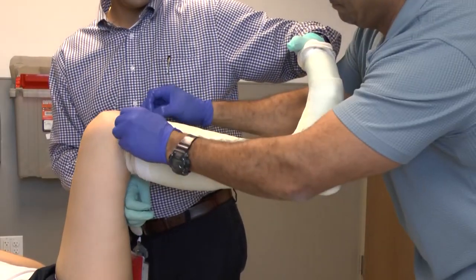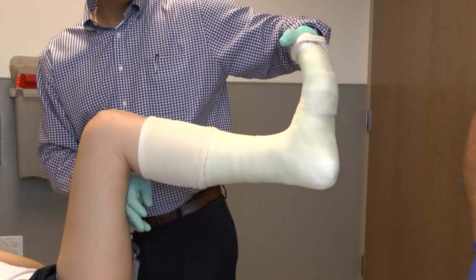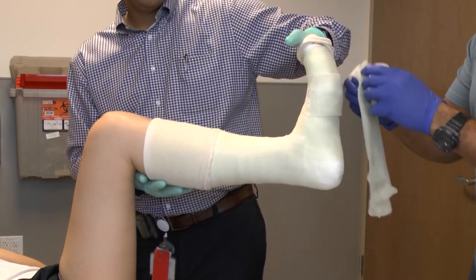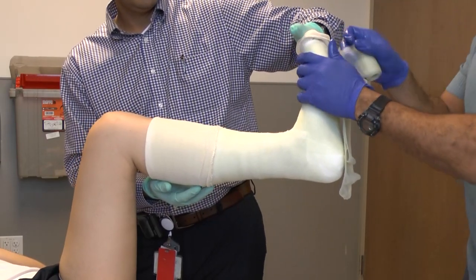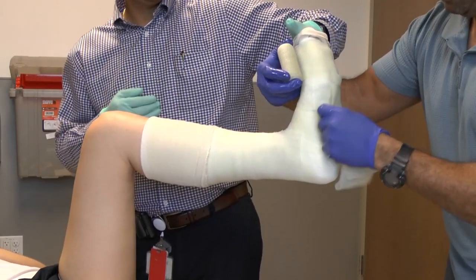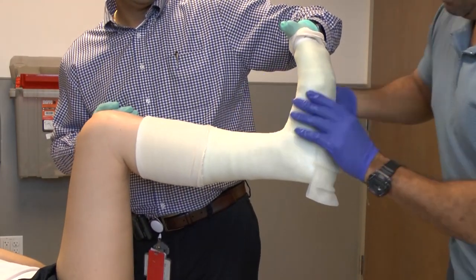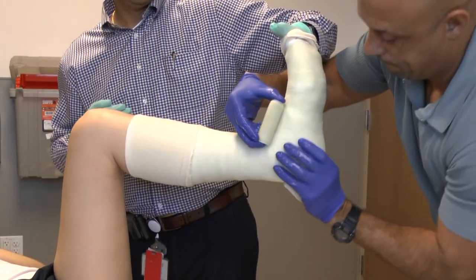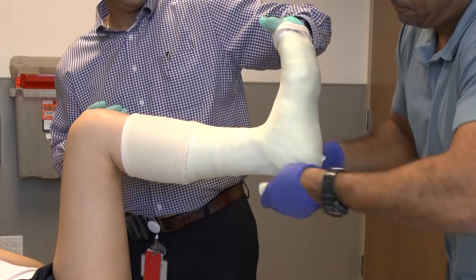It's also important to make sure that your holder is not placing their fingers into the fiberglass. We can then fold down the stockinette, predominantly first at the upper tibia. Lower down, it's important to make a reinforcing splint that will allow this to be a walking cast. This is done by rolling out the fiberglass ahead of time into a splint fashion and then applying it as shown.